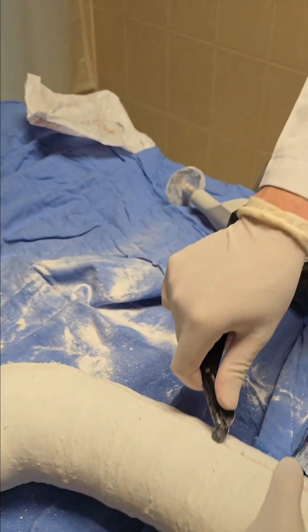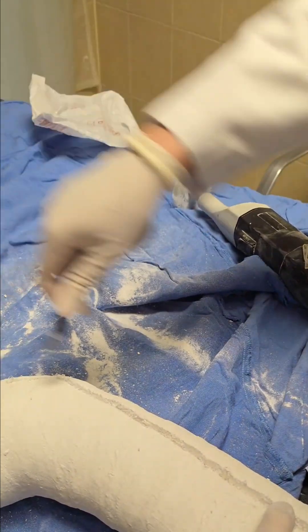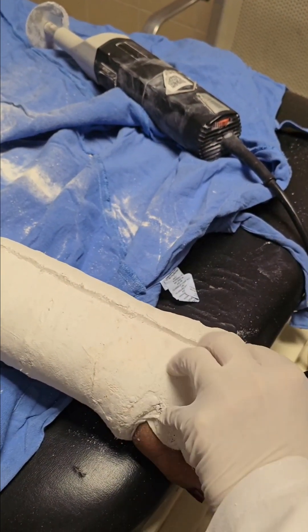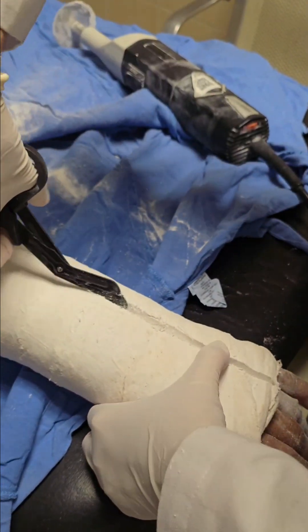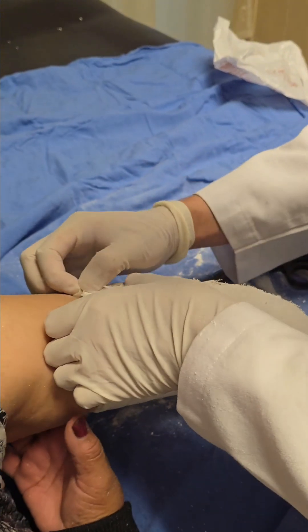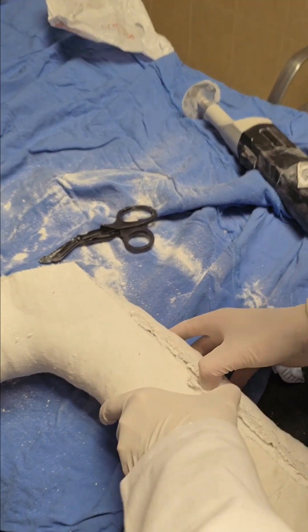Step three: splitting the cast. Once the cuts are complete, a cast spreader is used to carefully pry the cast apart. This tool is designed to gently open the cast without putting undue stress on your wrist or skin. At this stage, the patient might feel some pressure, but it should not be painful. Step four: final removal. The two halves of the cast are then lifted away, revealing your wrist. Any padding underneath is also removed, allowing the provider to inspect the skin and the wrist itself. Your wrist might look pale or feel stiff, which is completely normal after being immobilized for several weeks.